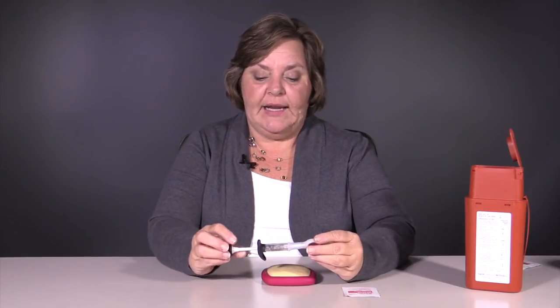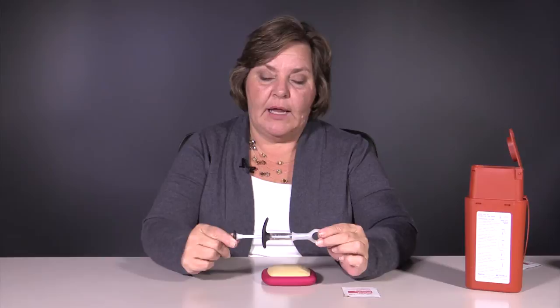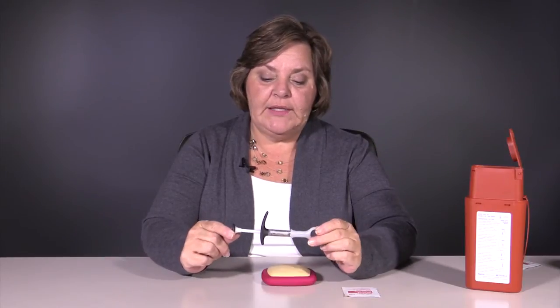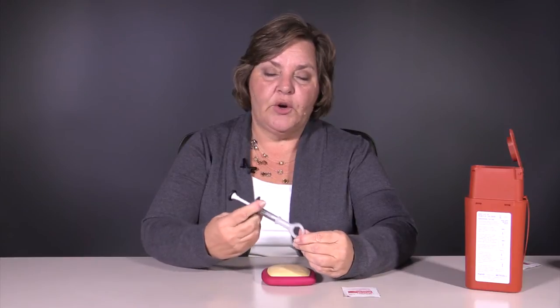Hi, today we're going to learn how to inject Symsia. Symsia is a TNF inhibitor that comes in a pre-filled syringe. This syringe may look a little odd to you, but there was a lot of design concern put into this so that people with perhaps weaker hands would be able to hold on to it.